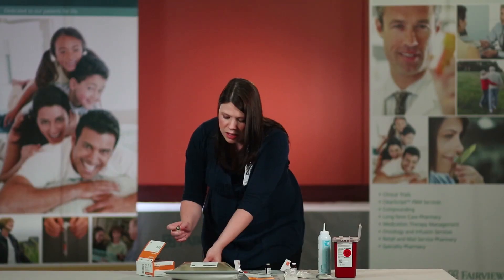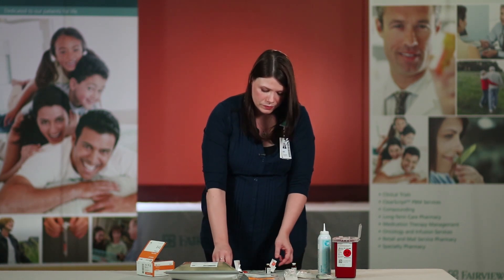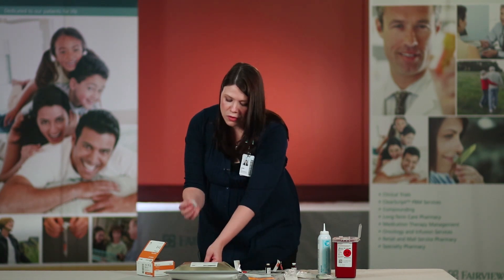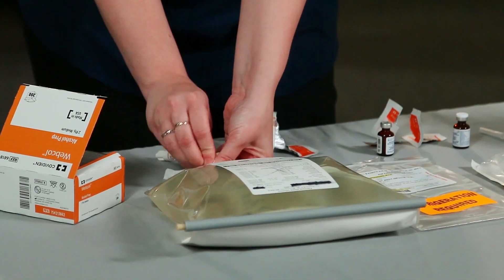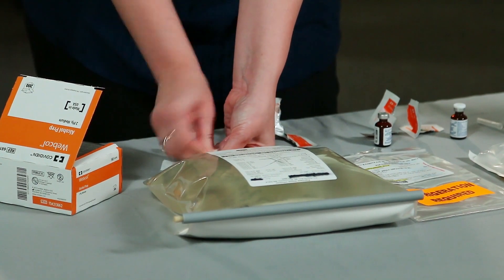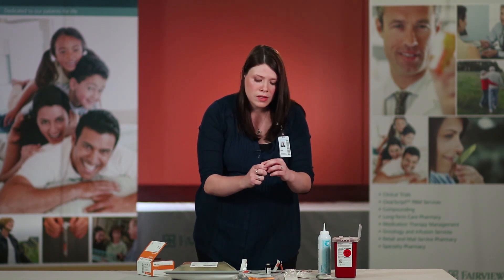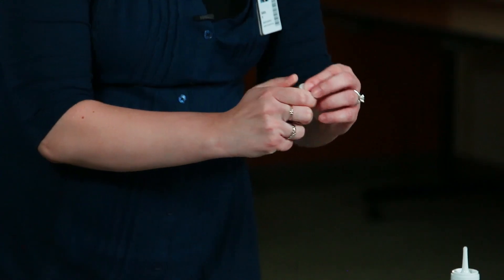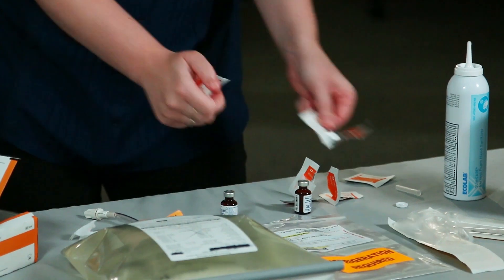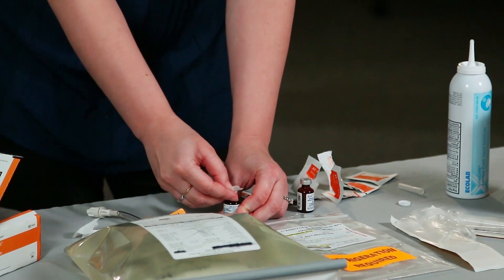Remove the needle and discard in the sharps container. For your second vial, you are going to do the same thing: using a fresh alcohol pad, scrub the port of your TPN for 15 seconds using good friction and scrubbing motion, and with a fresh alcohol pad scrub the top of that vial for 15 seconds using good friction and scrubbing motion.